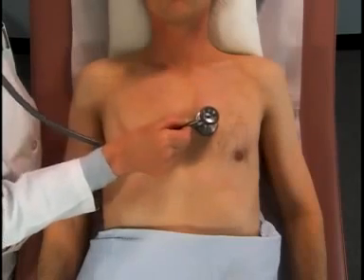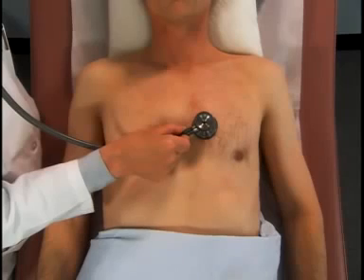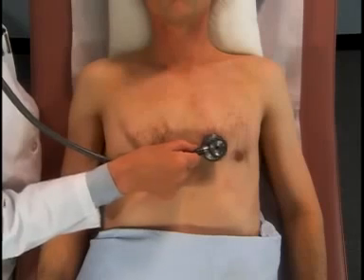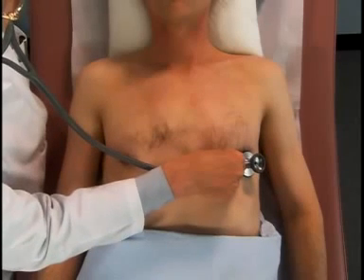Now breathe normally. S2 usually diminishes in intensity, while S1 becomes louder as you proceed down through the third interspace and into the tricuspid area. Listen at the apex. Here, at the mitral area, S1 is usually louder than S2.